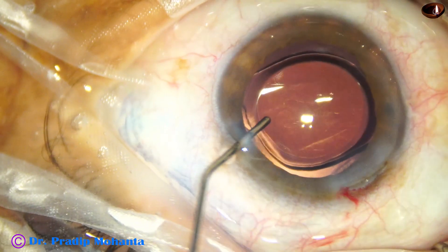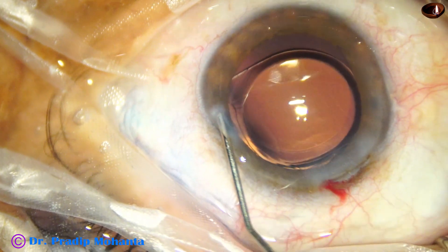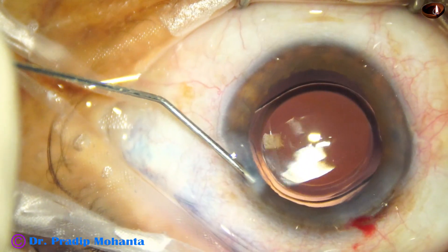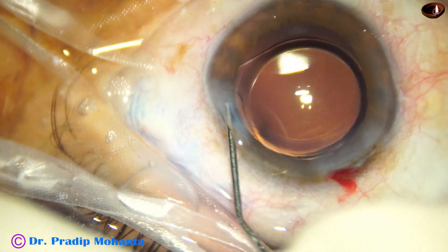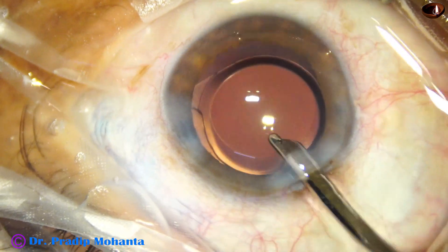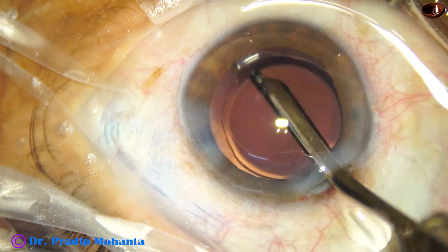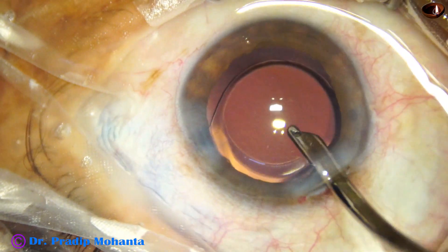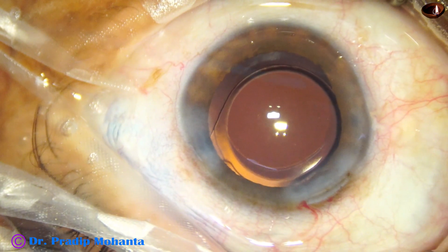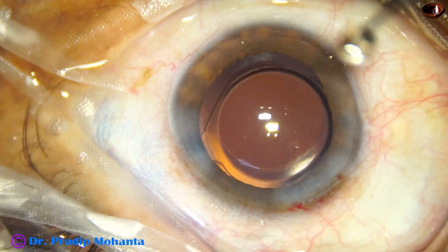This is Miochol. The side ports are closed by hydrating the corneal stroma with BSS. Our final lavage of the anterior chamber is done by the SIMCO cannula. SIMCO is very effective in forming the anterior chamber — we place it at the main wound and the anterior chamber is nicely formed. Integrity of the wounds is checked and the case is concluded.